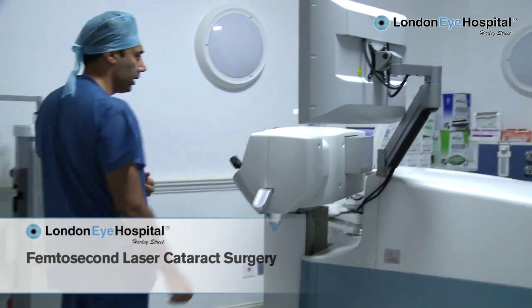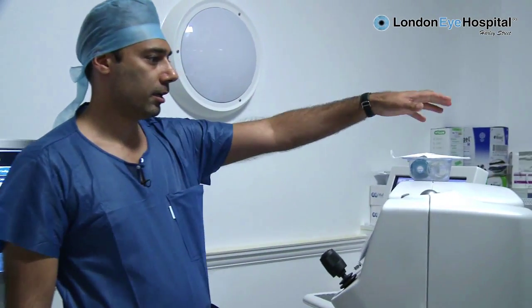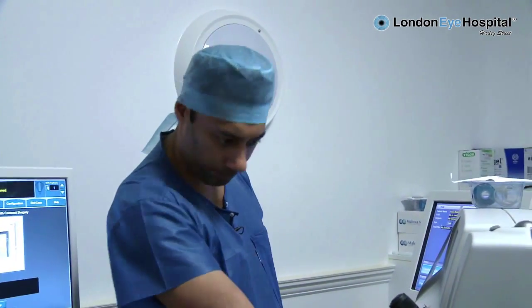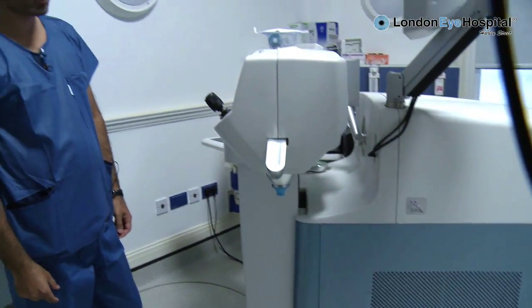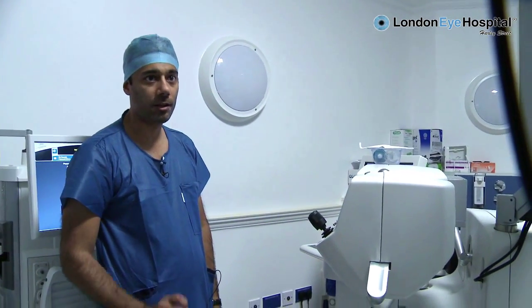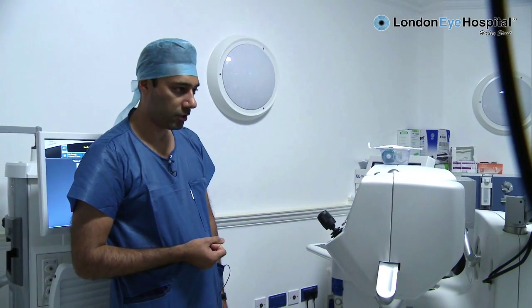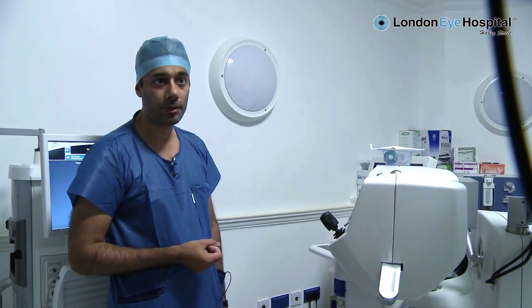This is a femtosecond cataract laser. Inside here is a laser device. It fires very short pulses of laser through this interface here. The pulses are in the femtosecond range, so that's one millionth of a billionth of a second — that's how long the pulse lasts. Essentially what it achieves is a very, very accurate cutting tool.